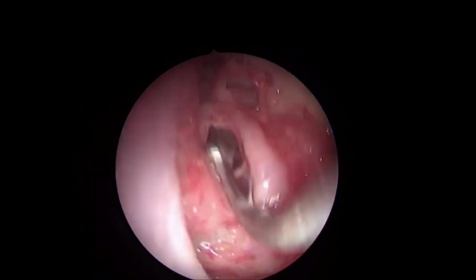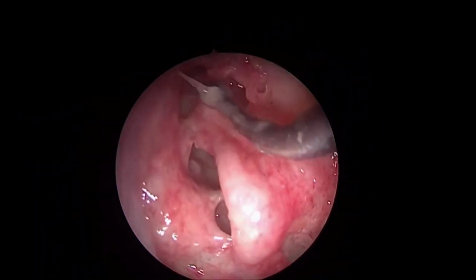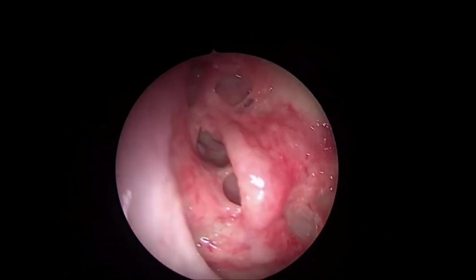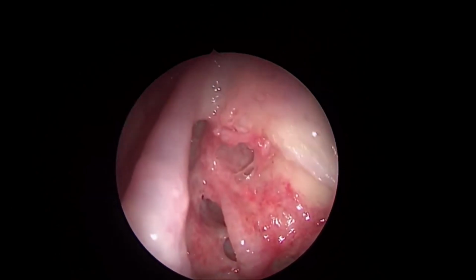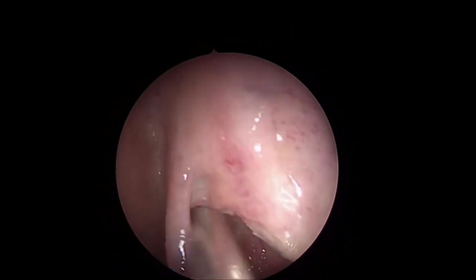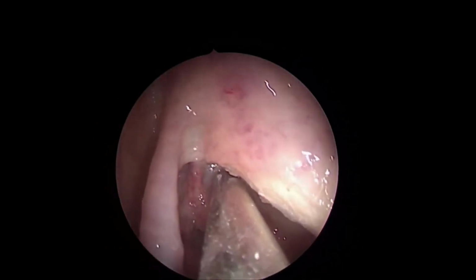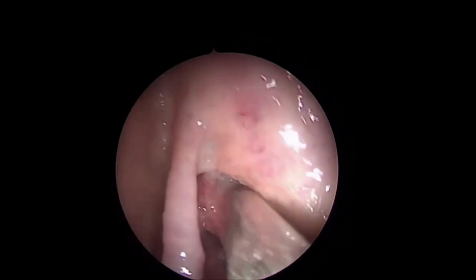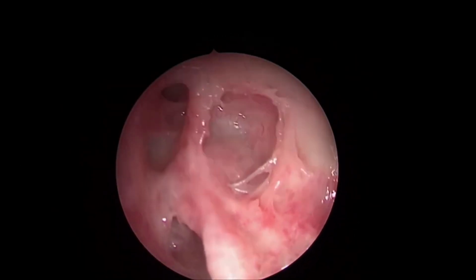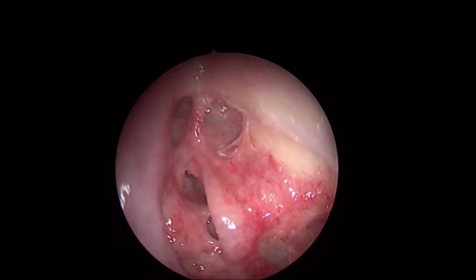Third is, I'll show you some landmark which God has given us, and I believe that is the most important landmark. And that is your beak. This frontal beak is one thing which has made our life difficult. By making this frontal sinus access so difficult, as the beak always comes in the way, and made the frontal sinus so high up, strategically located.